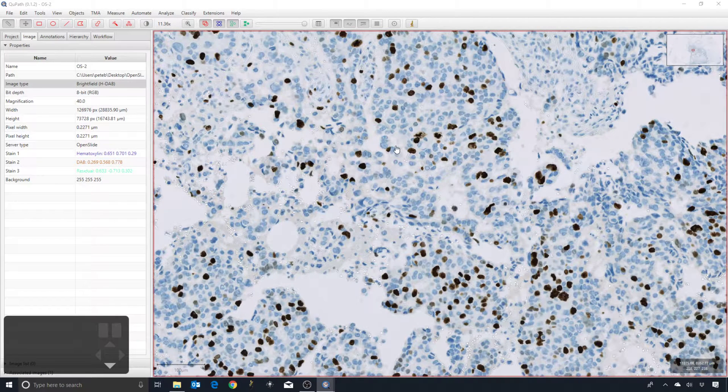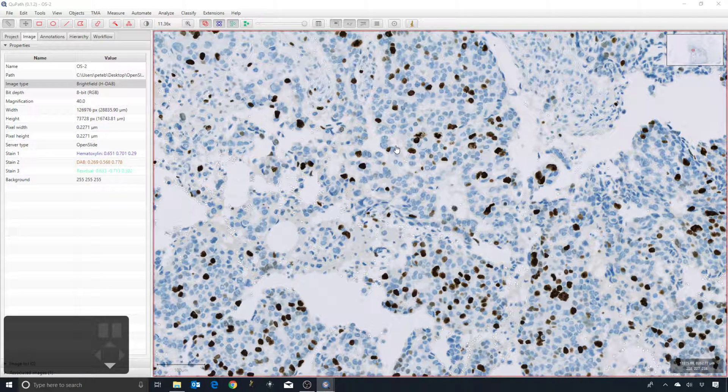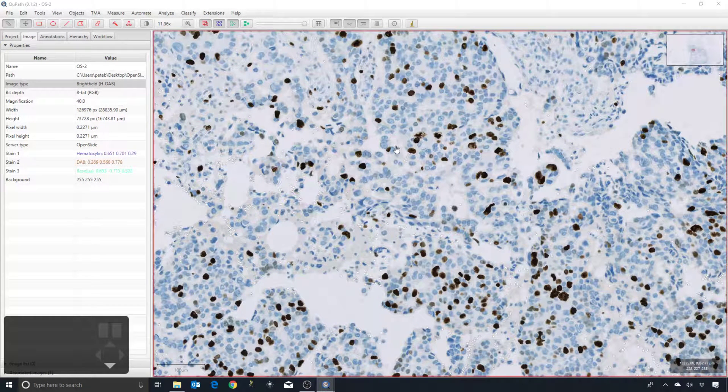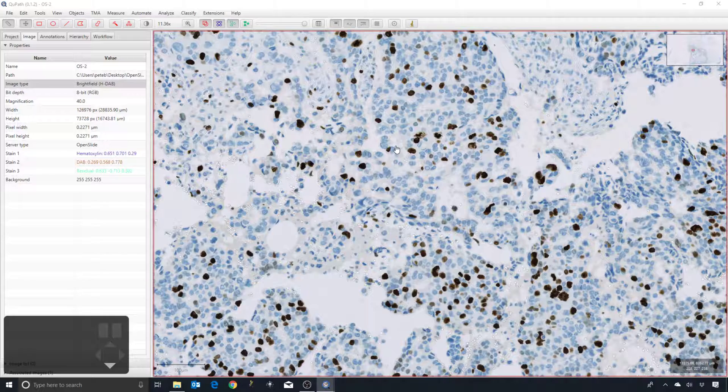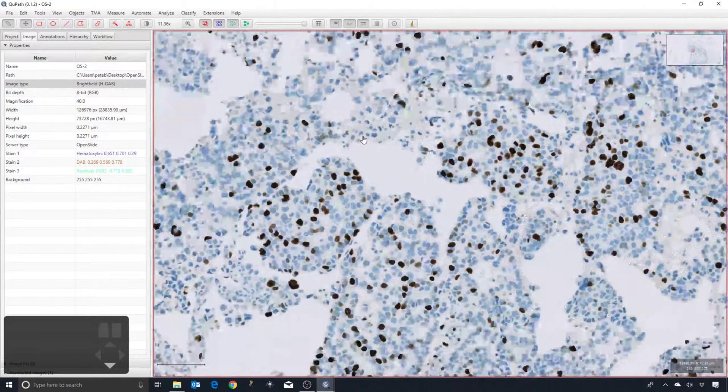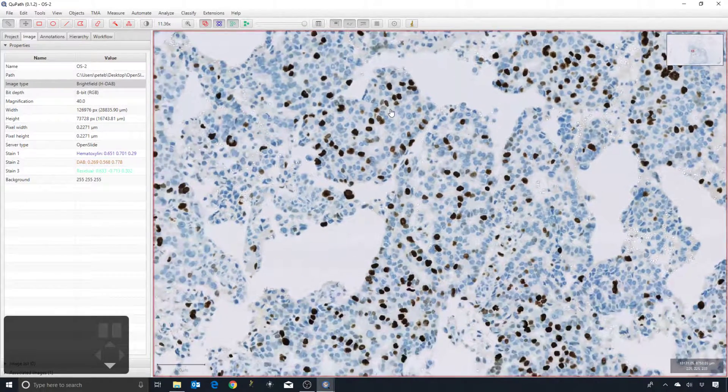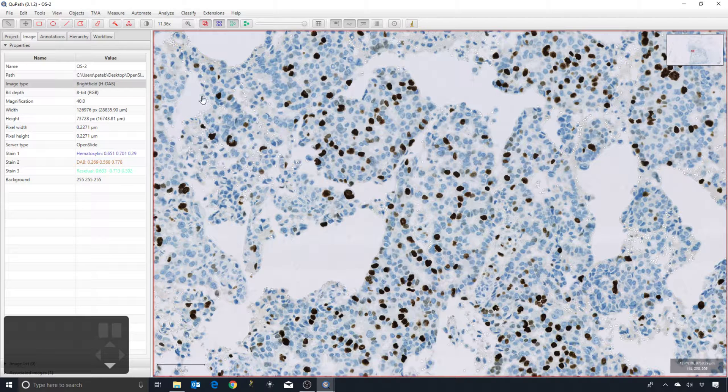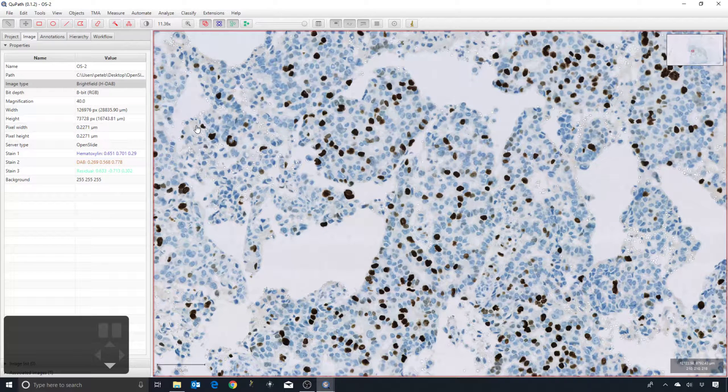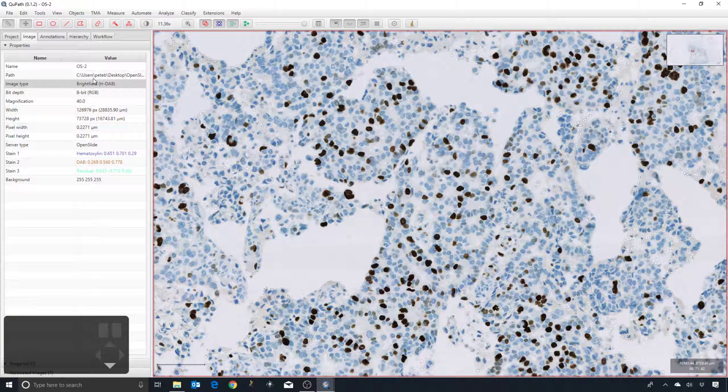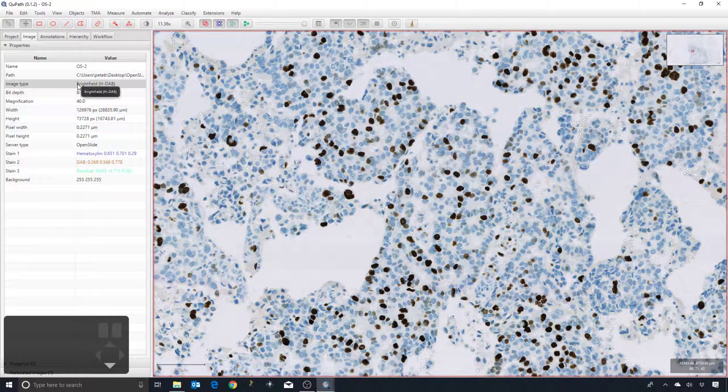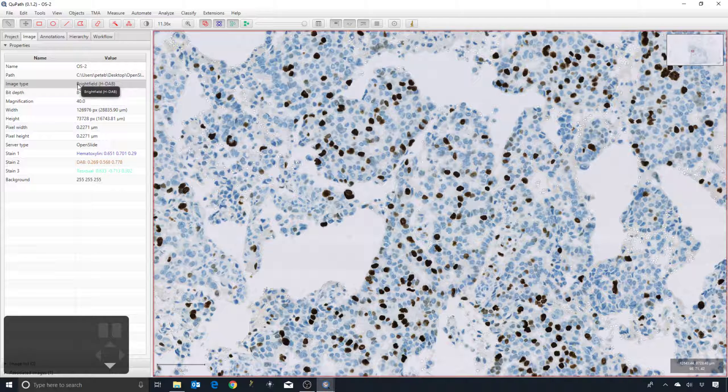I'm going to show you something now that I don't necessarily always do, but what is possible is that you can refine the stain estimates that QuPath uses. I said that it automatically estimates the image type, and in this case it's got it right as being H&DAB.